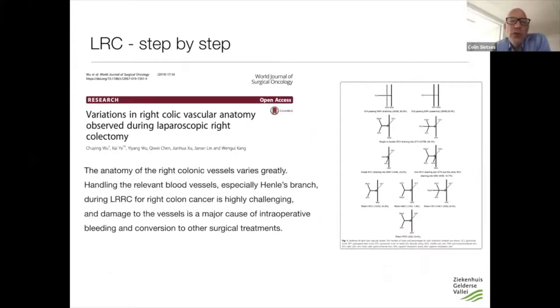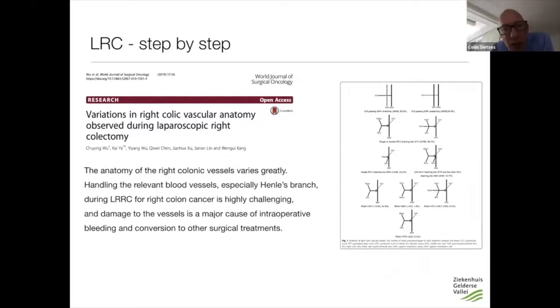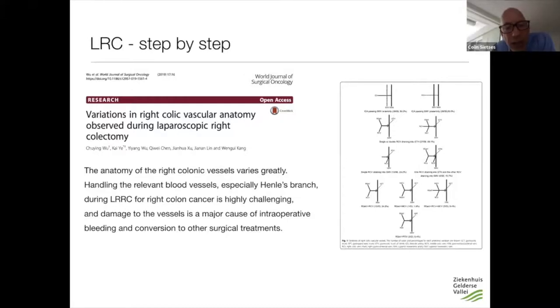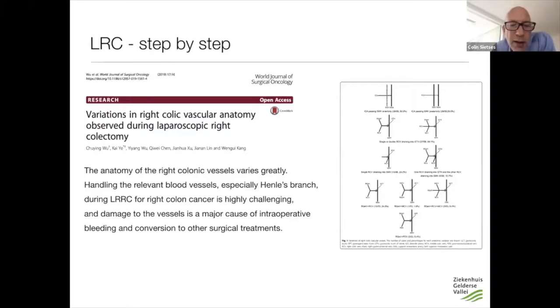You should also realize that the anatomy varies a lot. The vascular reconstruction shows this, but it also makes it really difficult. There is a big risk for intraoperative complications like bleeding or lesions or serious damage to the superior mesenteric vein, and you can really hurt your patients if you don't know what you're doing.